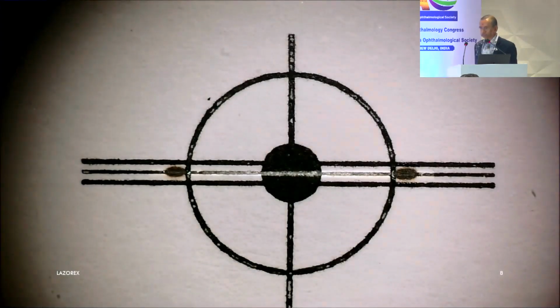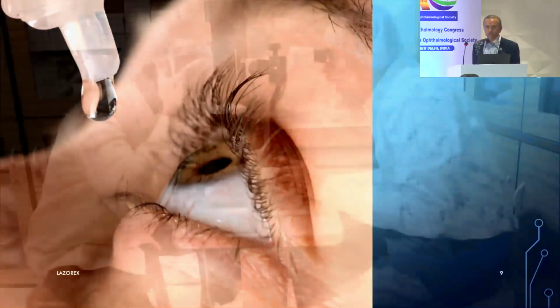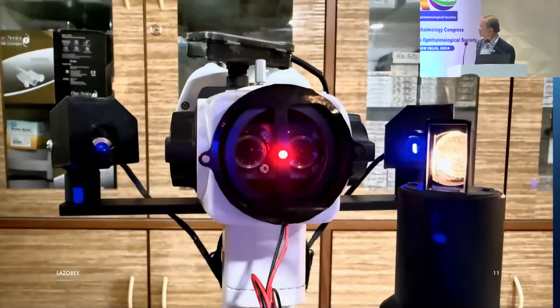After numbing the conjunctiva with proparacaine eye drops, the patient is taken on the slit lamp and the head is best aligned. With the other eye closed, the patient is asked to fixate on this central red target light, which also gives a red Purkinje 1 image on the cornea, denoting the actual and real position of the visual axis in the pupillary area of the cornea.